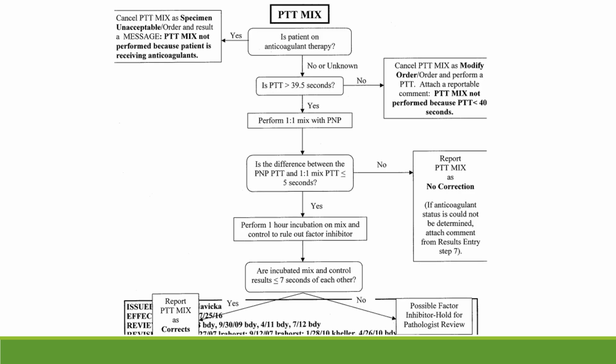Are the incubated mix and control results within less than or equal to 7 seconds of each other? If yes, we can report now our PTT mixing study as a correction, which would indicate that we have a factor deficiency somewhere in the intrinsic pathway. And if no, then we will hold it for pathology to investigate for a possible factor inhibition or inhibitor.